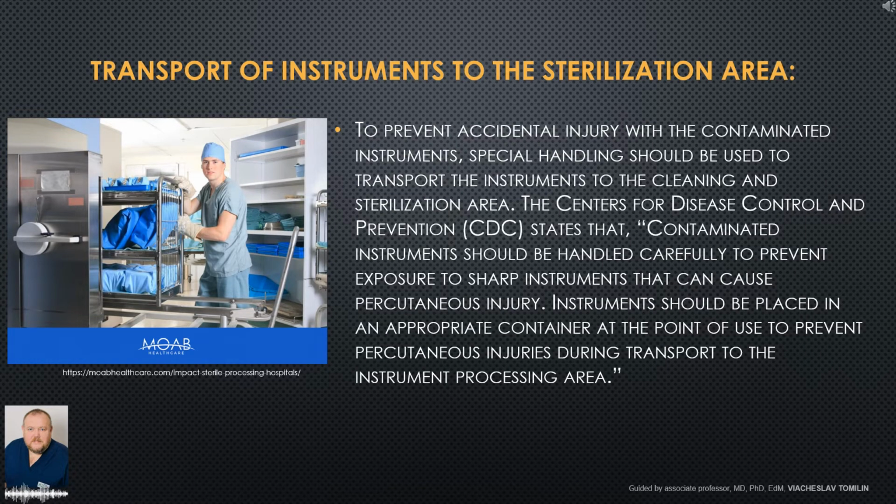Transport of instruments to the sterilization area. To prevent accidental injury with the contaminated instruments, special handling should be used to transport the instruments to the cleaning and sterilization area. The Centers for Disease Control and Prevention, CDC, states that contaminated instruments should be handled carefully to prevent exposure to sharp instruments that can cause percutaneous injury.